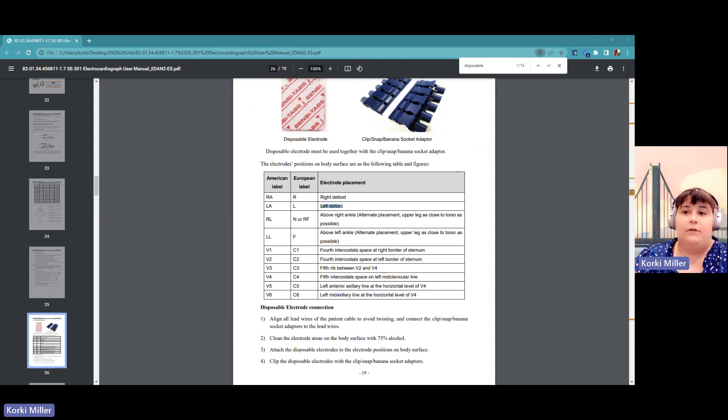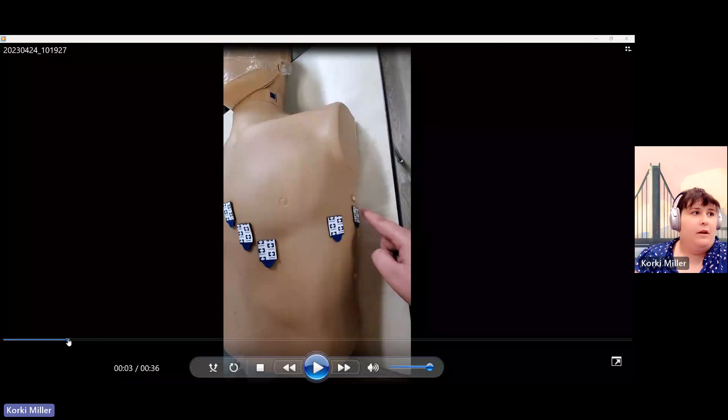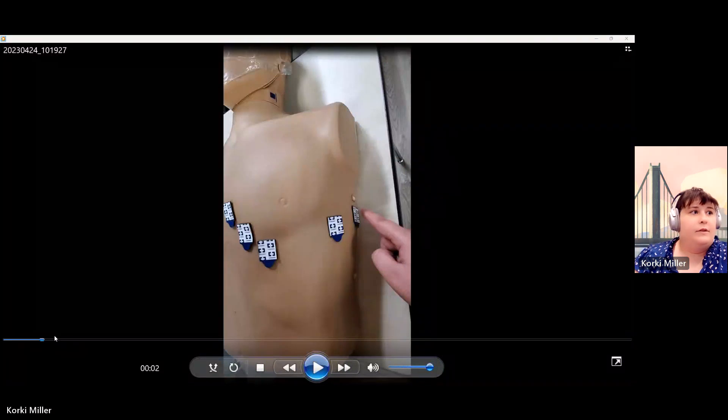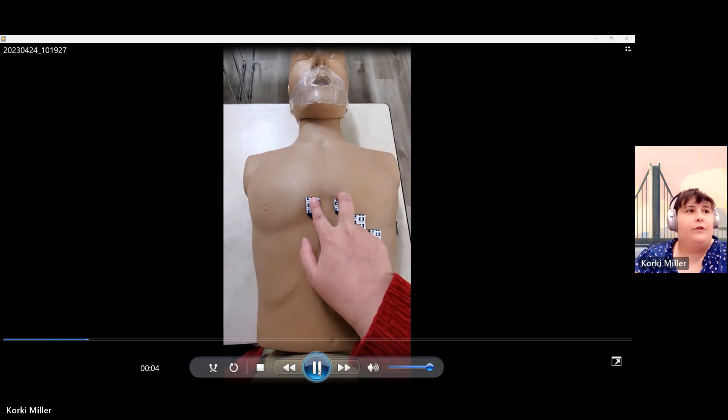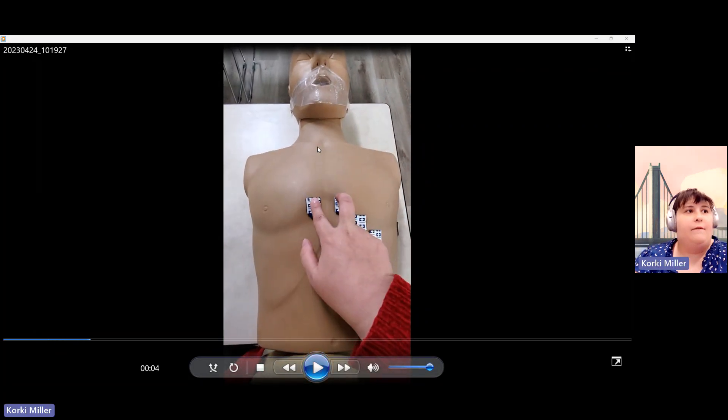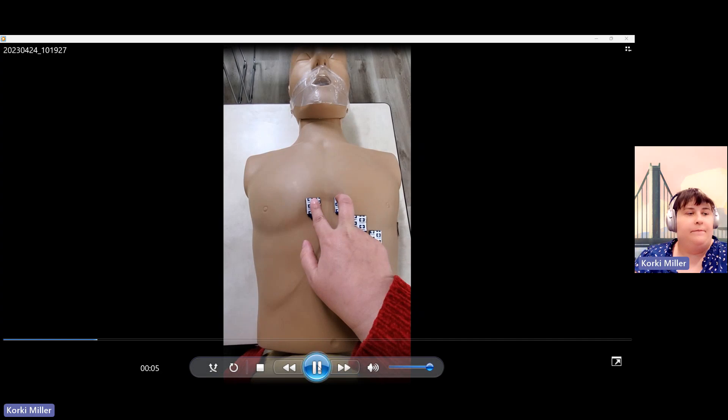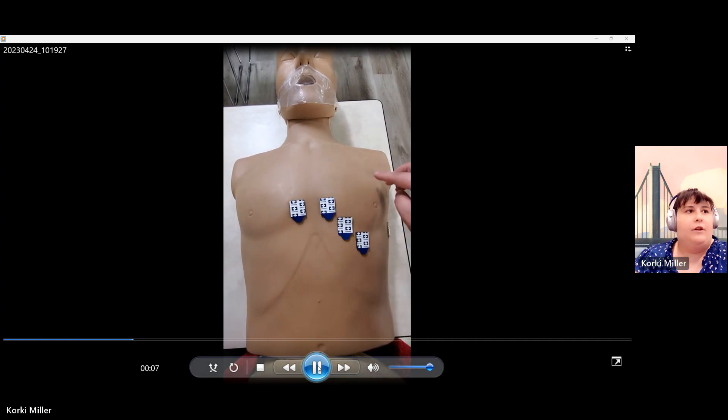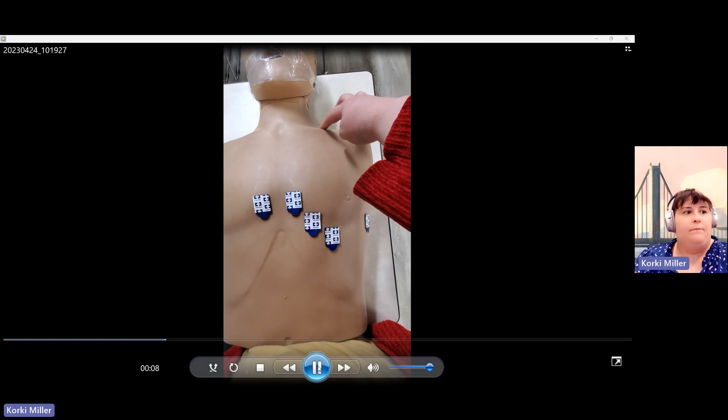Another item that we're going to view is a video on how to place the V1 through V6. I have to talk over this video because the audio is not carrying over. On this video, you're going to have the V1 and the V2 on either side of the sternum towards the nipple line.